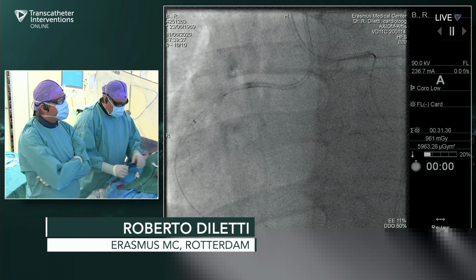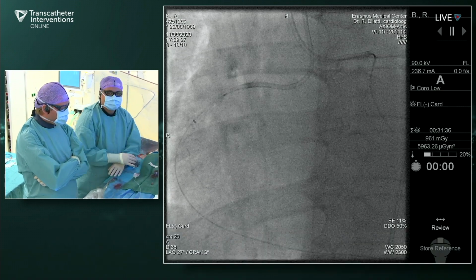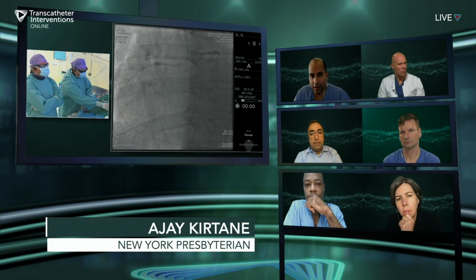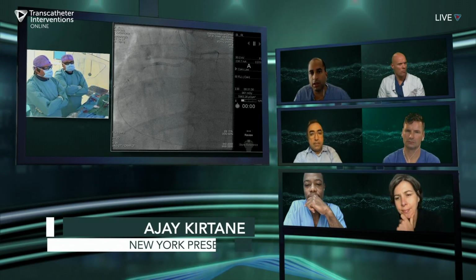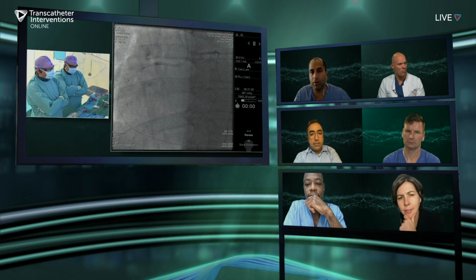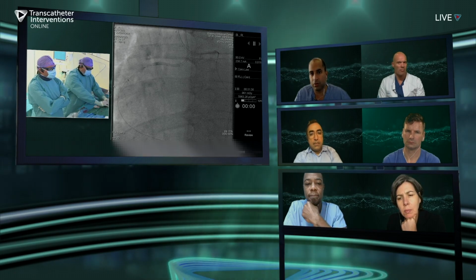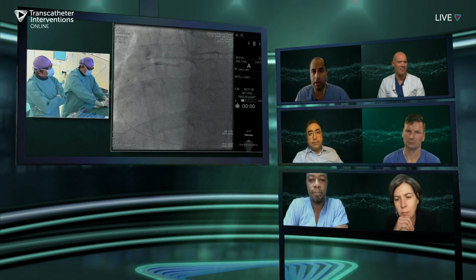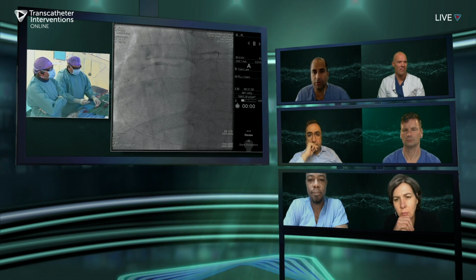Do you have, Roberto, any question at this point? Roberto, that's fantastic. Just hold on one second so we can explain to the audience basically what happened. So the wire went across, then the microcatheter went across, and then we tried to advance the wire retrogradely, but couldn't get progress that way. And so when you can't get progress, you have to make a channel and somehow get things moving antegrade. And it's facilitated by the balloon with a guide extension. You then extend where your guide is, and that allows your retrograde wire to advance into the guide extension. So you did it really quickly. You did it very elegantly.